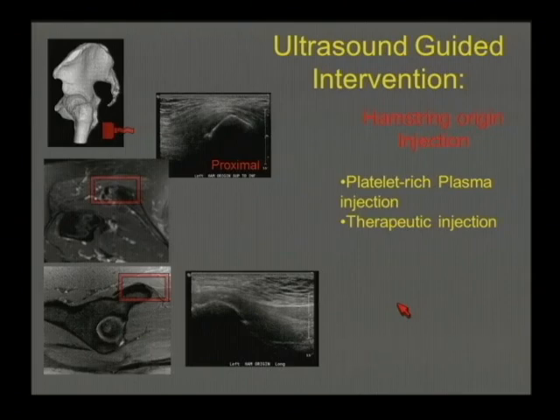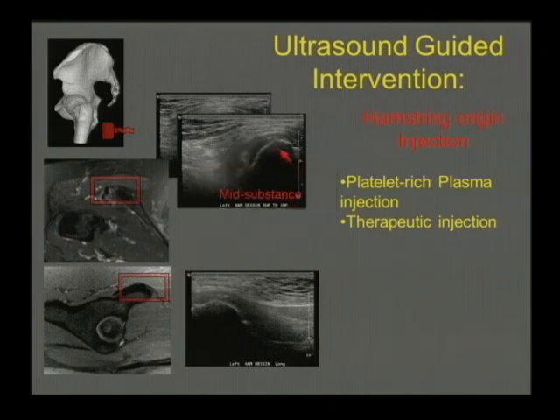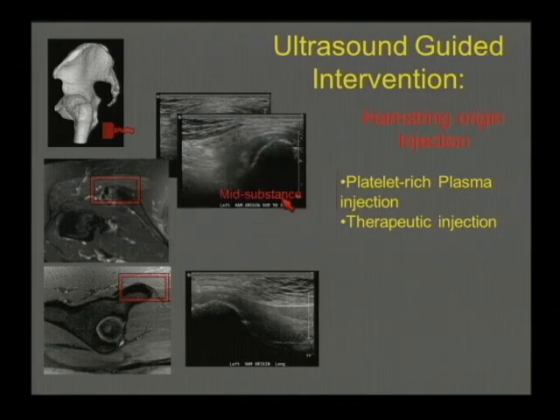So these are the corresponding ultrasound images. I've reoriented the MR here to show the origin of the structures at a relatively normal appearance proximally, but coming through a little bit more distally into the tendon in the transverse plane, you can see this more heterogeneous echotexture, a few small areas that are more echogenic, perhaps a few little ossicles that are forming at that location. So certainly some sonographic evidence of abnormality at the tendon origins.